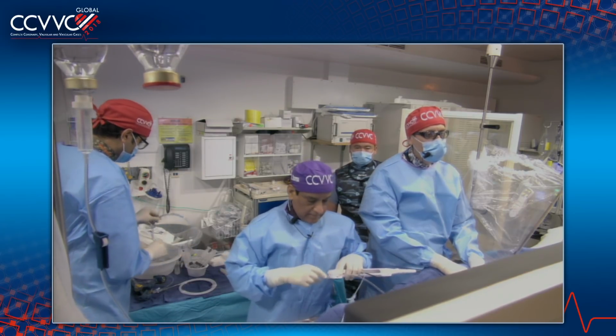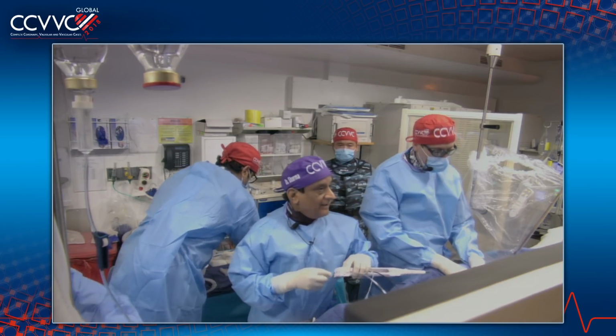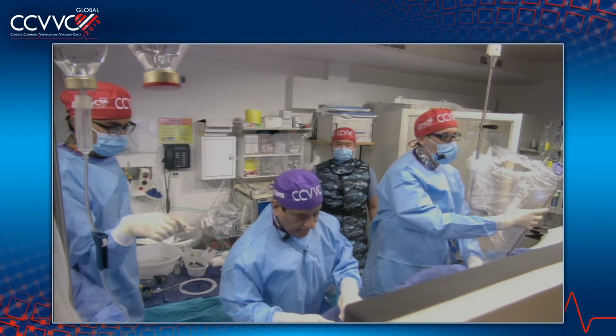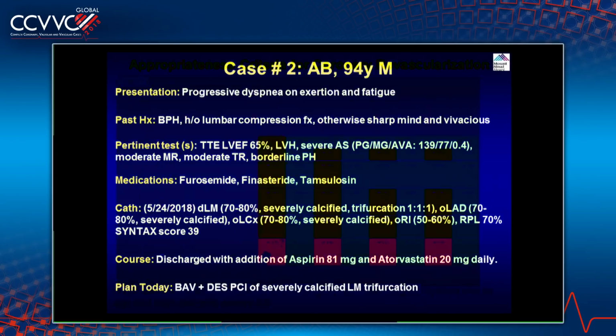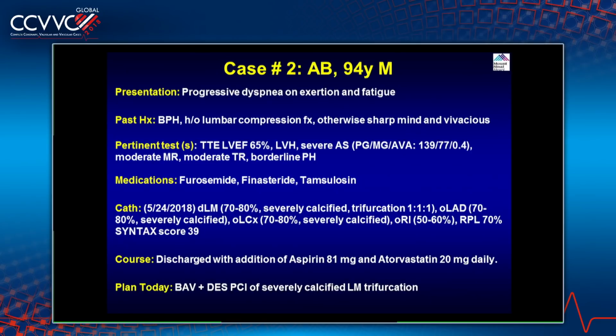It's a very complex case with multiple steps. We already completed a couple of them. Okay, already completed a couple of steps. All right, let's go to slide number 2. Case number 2 here. Go back, please, to the presentation. Good, there we go.